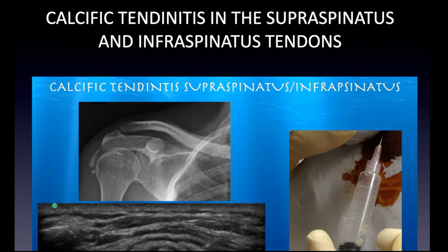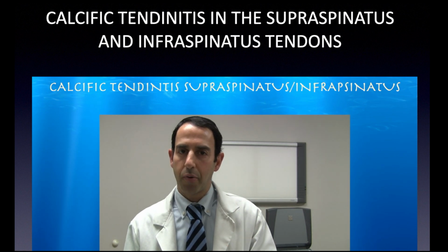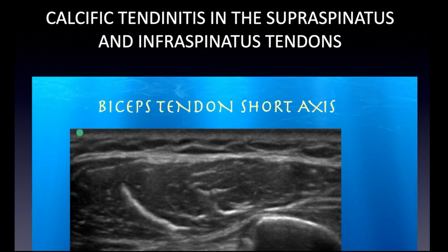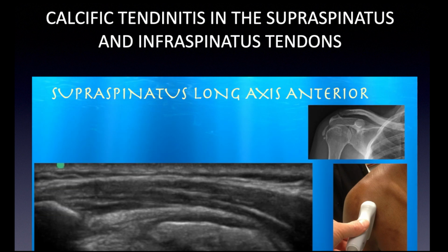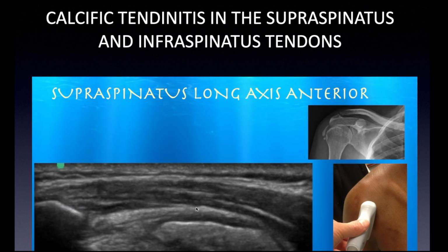I usually do get x-rays just to make sure nothing crazy is going on, but it's also nice to see that calcium on x-ray. So here you can see this globular teardrop calcium sign on x-ray. Here we're just doing a routine scan, and here is this calcium. So again, going through your layers, deltoid muscle, here is basically the subdeltoid fascia, part of the subdeltoid bursa, intermixed. And here, this little sliver is actually the subdeltoid bursa. Does everyone see that? It's pretty subtle.